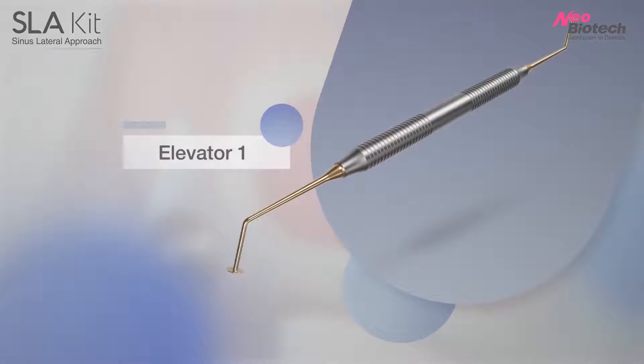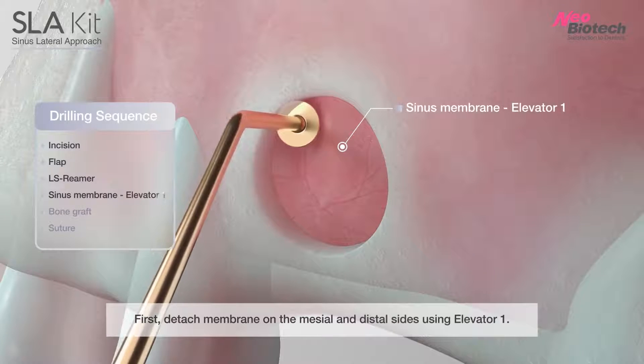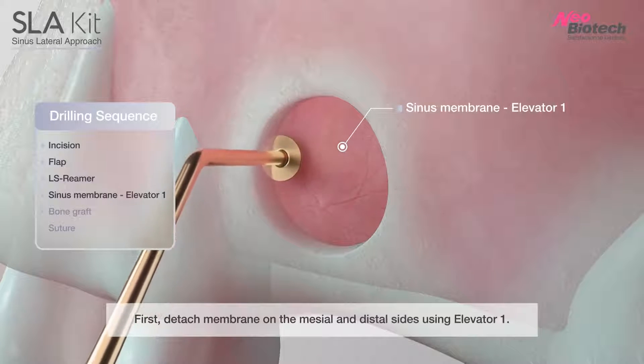Number 1 Sinus Elevator: First, detach the membrane on the mesial and distal sides using the Number 1 Elevator.